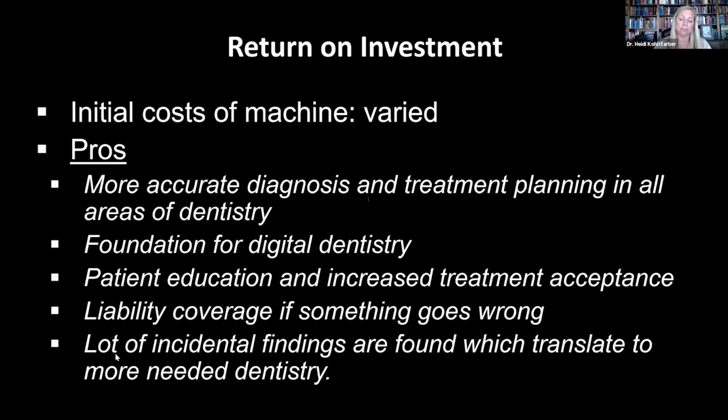You can plan your implant. You can send them home with, say, the volume and the plan on a thumb drive. They can sit and look through it. They can share it with their neighbors, with their family members. We could see an increase in treatment acceptance with our CBCTs because the patient can see exactly what's going on.